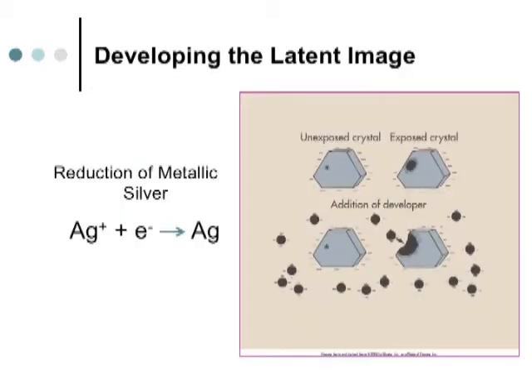Now what's happening inside: the film is made out of silver bromide, another term is silver halide, and when we expose the film to light or X-ray, it ionizes the silver bromide crystal. So the silver breaks apart from the bromide, silver becomes positively charged, bromide becomes negatively charged, and all of the silver will migrate to what's called the sensitivity speck, which is made out of sulfur.